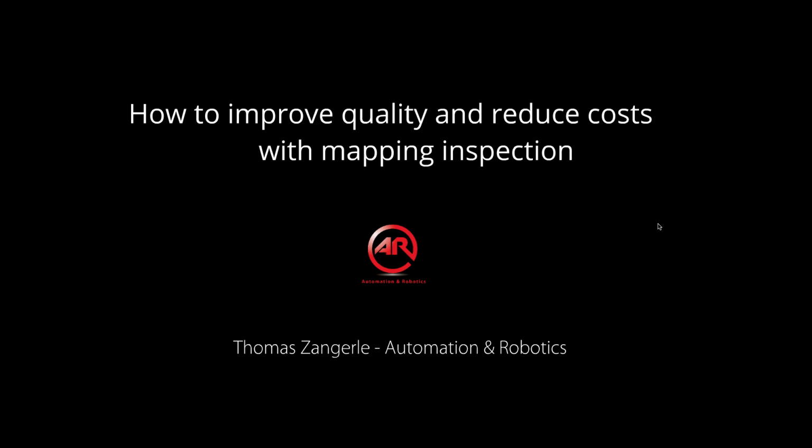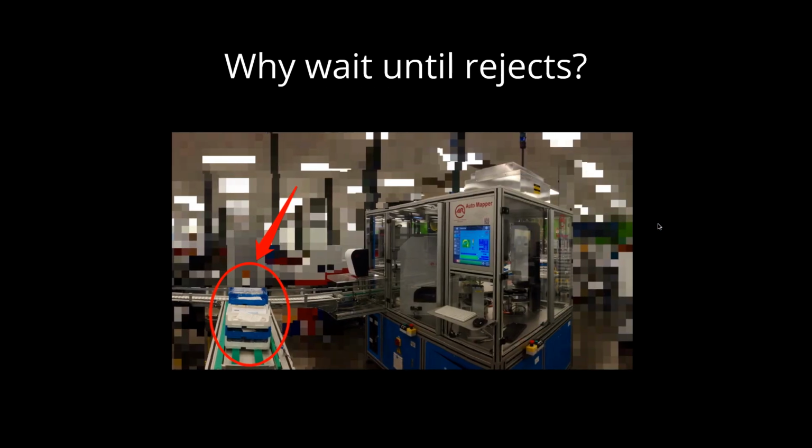Hi everyone. I'd like to start this presentation with a story. It happened last year during the installation of an inspection machine. When lenses are rejected for power, a ticket is usually printed with the inspection values and it is dropped in the job tray. Well, one of the lab supervisors asked us to print a certain value on the ticket. And the goal was to get more information about the origin of the problem.